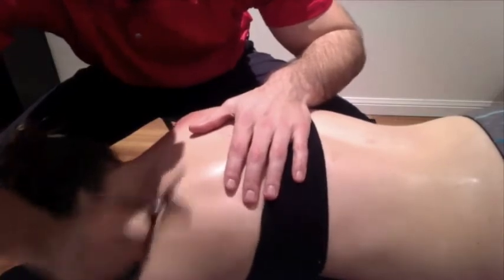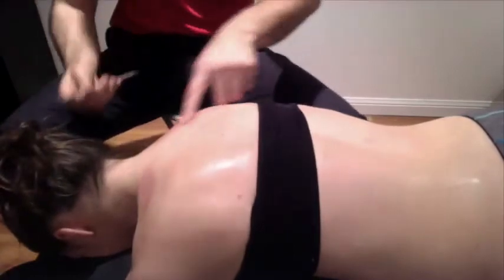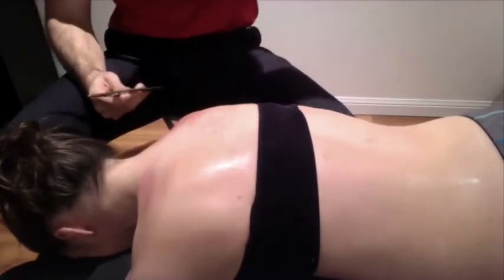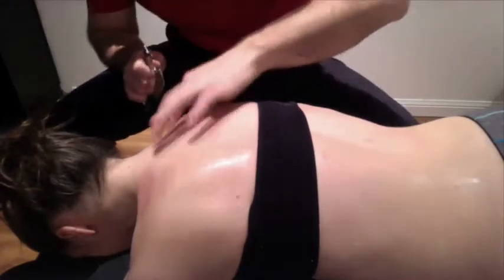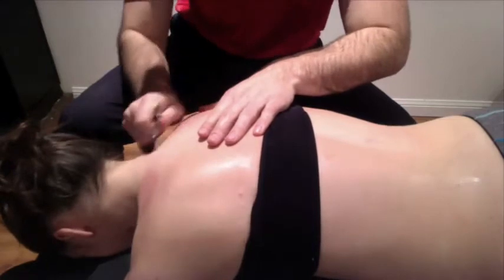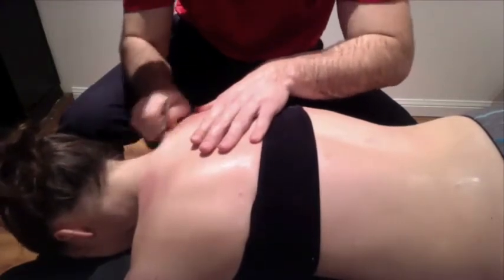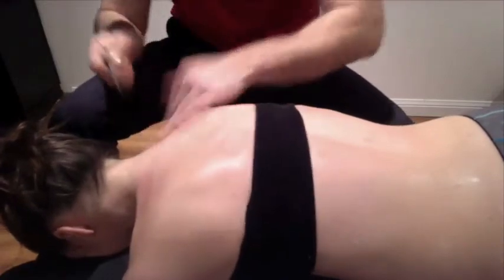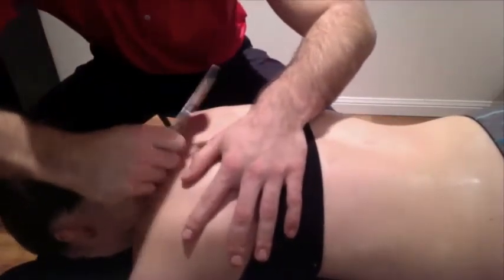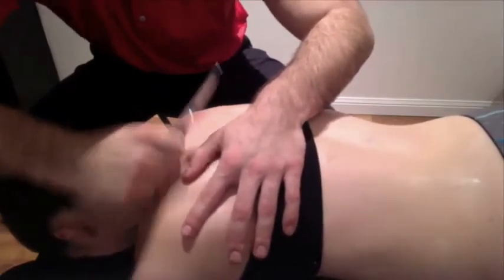Again, taking that number two edge at a 45-degree angle, working through those traps. You can see there's a little bit of redness right through that sort of attachment point of levator — obviously that's a little bit of an issue. So we're going to do the same thing and take levator up towards the neck on both sides with that number two edge. We don't need to get any more aggressive than that.